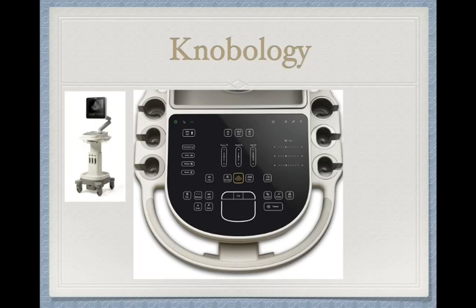All right, so we're in the last part here. Thanks for bearing with me, everybody. Just some quick stuff on the buttons of the machine. We'll go over this a little bit more with hands-on, but to get started, you want to be coming into your screen here. This is the sleep button. Hopefully the machine is on, and you can just push this moon and the screen will wake up. Otherwise, this is the on-off button.